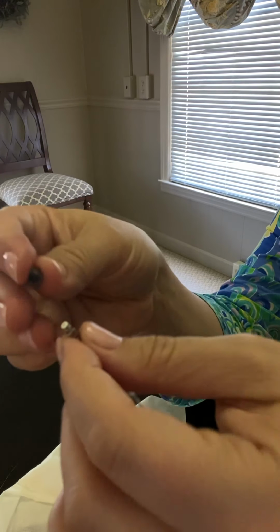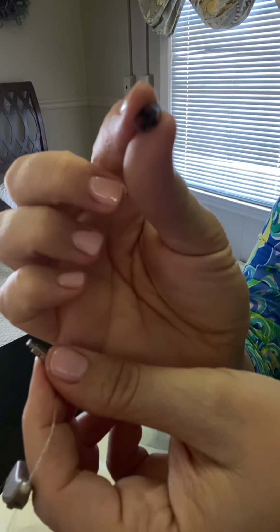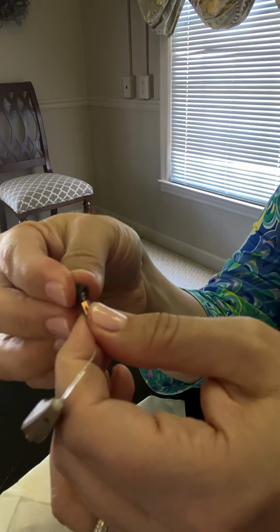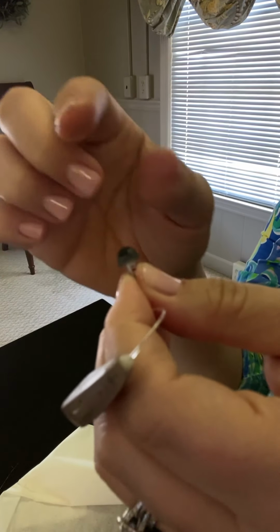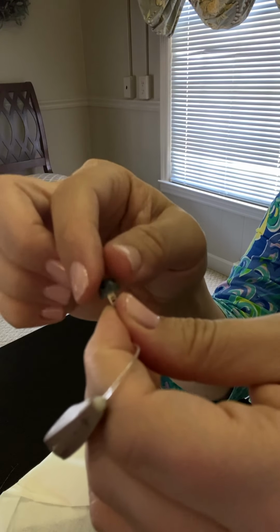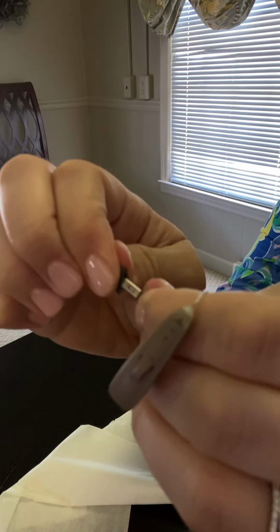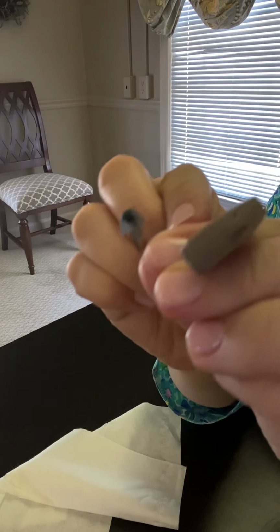Then you'd grab a new dome, or if your old one's clean, there's a hole in the middle of the dome. It's difficult to see on the video. You want this speaker to fit right in that hole where it's very secure. So I recommend to push it on and then give it a little tug to make sure it's secure, and then push it again for any movement you've made with that tug. You can do that as many times as you need to, but it should be very secure. You should not be able to easily pull it off. It takes quite a bit of grip, which is how the tissue's handy when you intend to take it off, and quite a bit of force. That's how you change your dome.